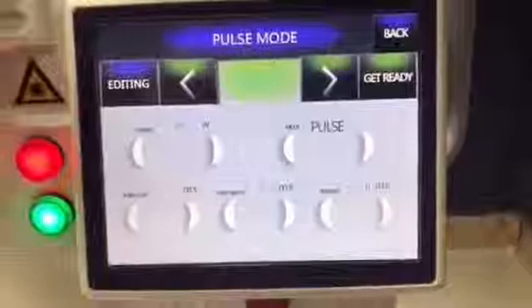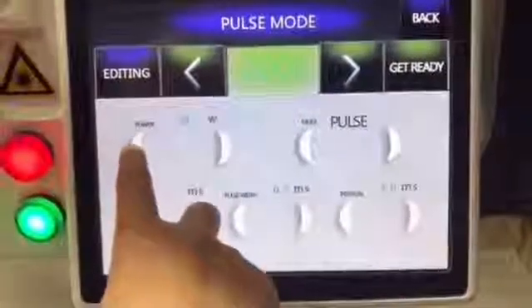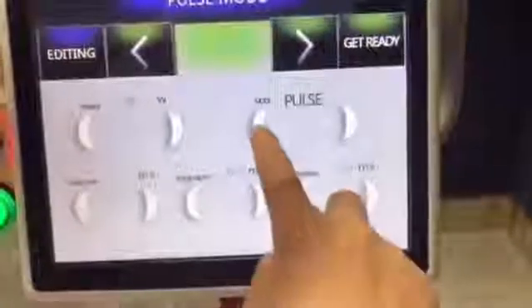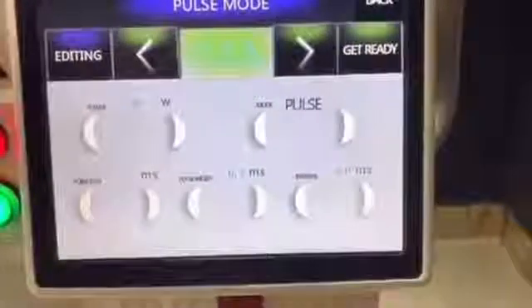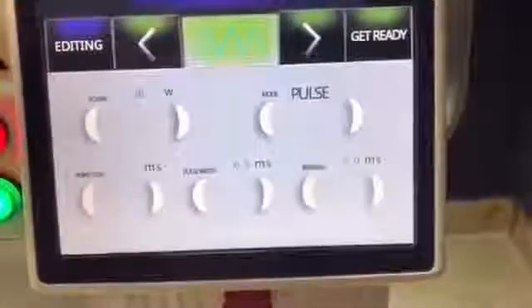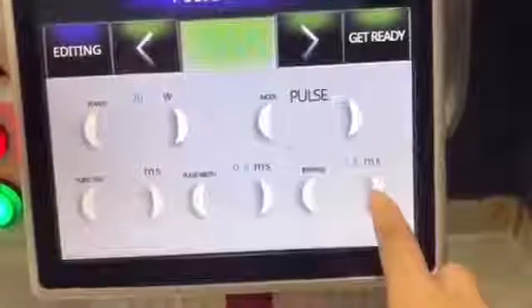Pulse mode is for mole and wart removal. Power is adjustable from 1 to 60. For treatment, we advise starting the power from 20. There are three mode choices; for treatment, we advise pulse mode. For pulse width, we advise 0.5. Interval time: we advise 60 to 70.